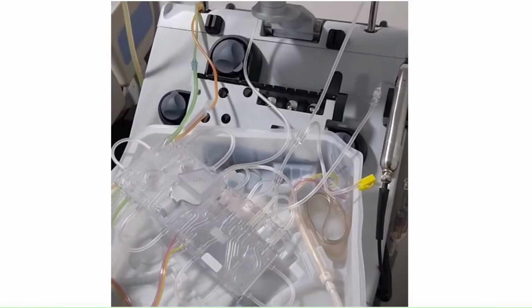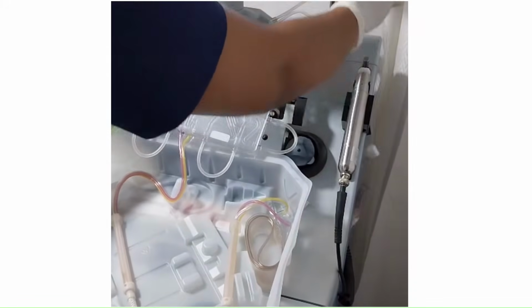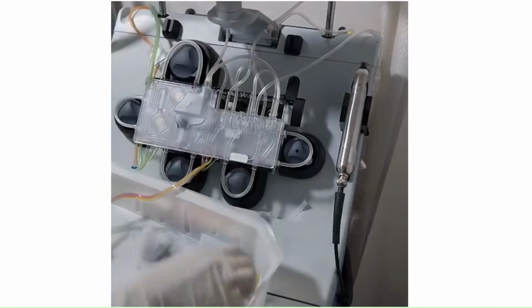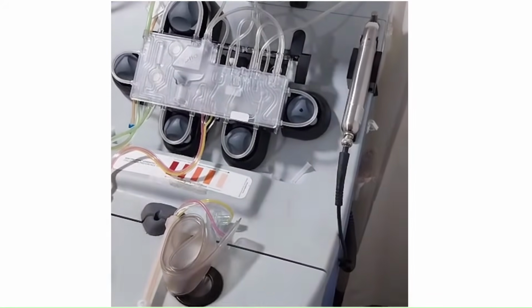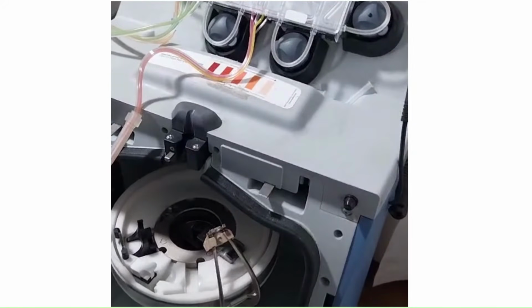Next we are going to place the cassette on the sensor board. Before placing, ensure there are no distractions and no disturbances, and gently place the cassette on the sensor board. After fixation, you will get a click sound. Then open the centrifuge.